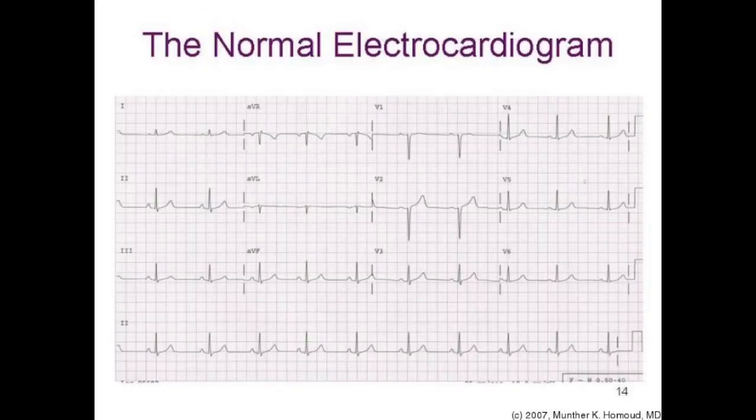So to summarize what we've covered in the basic principles of ECG analysis section, remember we have 12 different leads or vectors that we place on the heart to be able to pick up electrical activity from the heart from different angles to help us with representation.